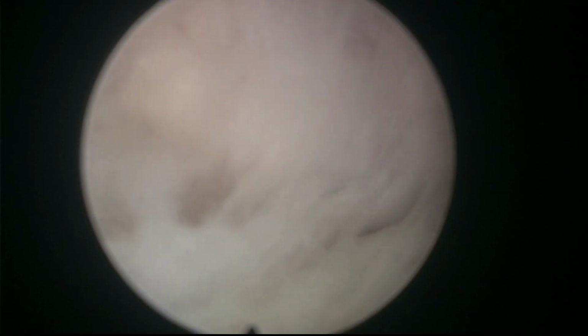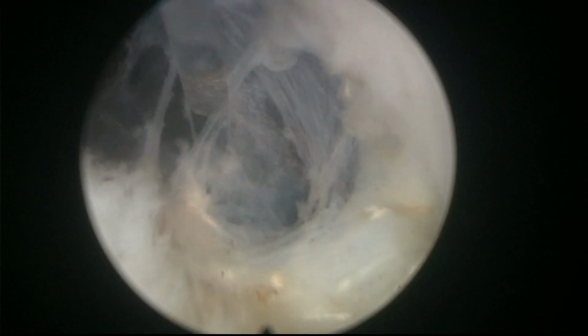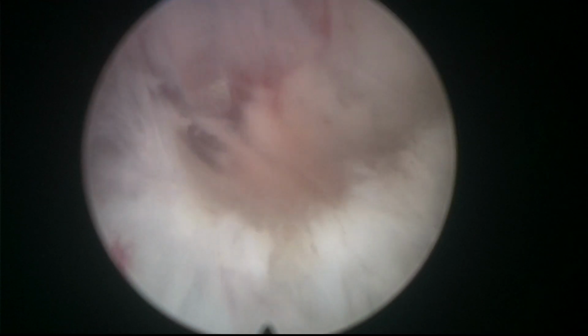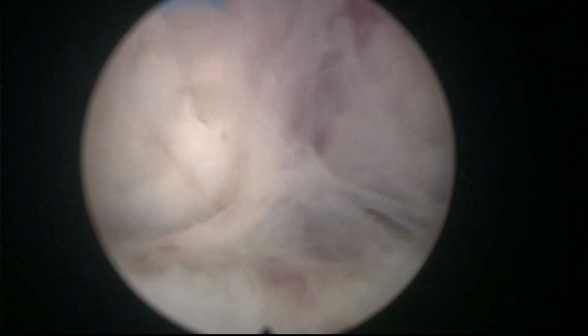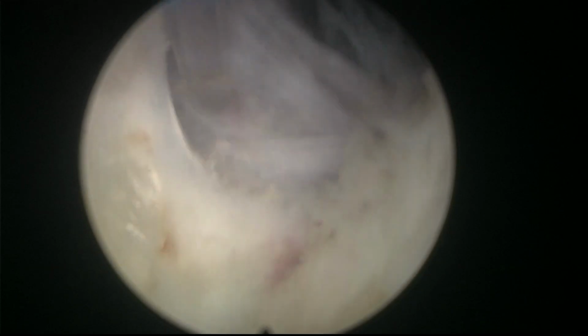Now I'm not forcing my scope at all to reach up there, and that's because having the scope on top of the adenoma brings everything downwards. Instead of having to tilt the scope upwards to reach 12 o'clock, by lowering the adenoma, the 12 o'clock region comes to you, more or less. So I don't often see that I split the sphincter at 12 o'clock trying to reach the uppermost part. This is one of the advantages of the en bloc technique. You don't have to use extreme force to reach 12 o'clock, which sometimes splits the mucosa of the sphincter a little bit at 12 o'clock.